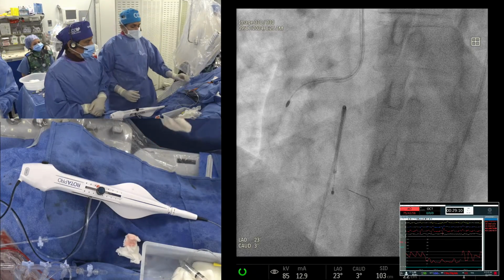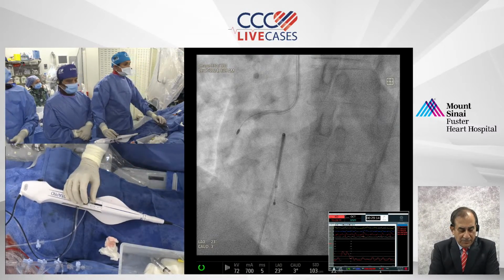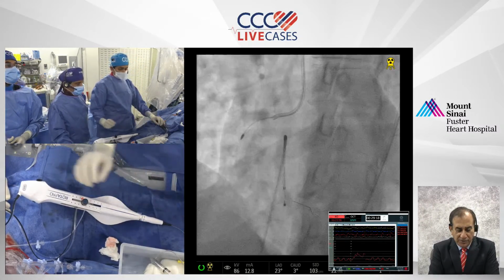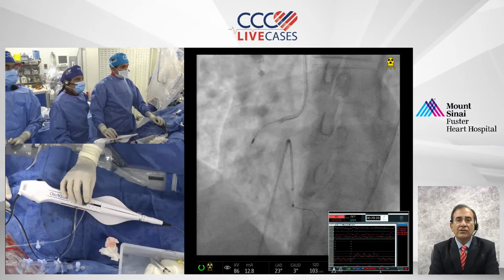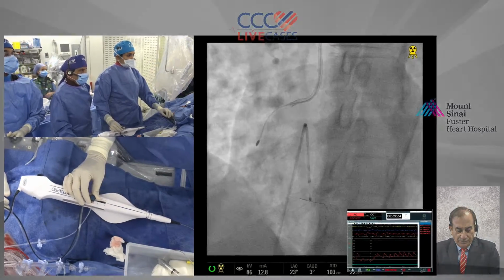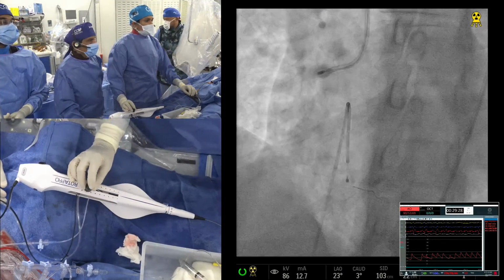Have you gone through that lesion? I mean, several questions have come in. Dr. Mahmood Al-Rais asks: if you could pass a 2.5 balloon, do you prefer to start with IVL or still use Rota? Yeah, that's a very good point. So we actually have that algorithm. In this case, although we'll call it a calcific nodule. Yes, I don't want to go there.